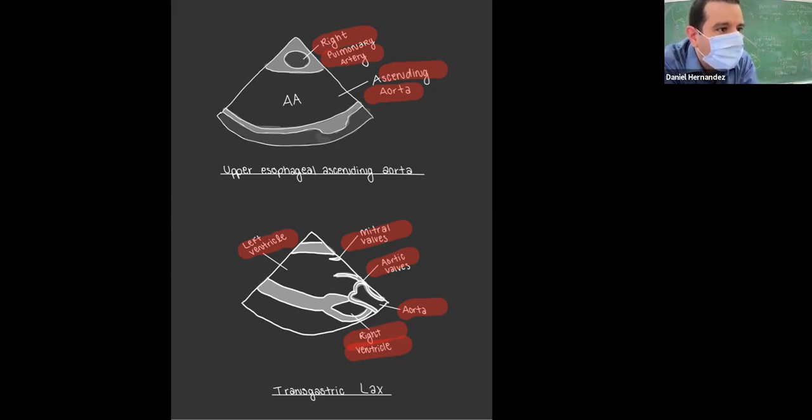I was trying to find the angle for that one, the pulmonary artery and the ascending aorta. Is the posterior mitral valve leaflet the one closer to the aortic valve? Yes. No, anterior. That's the anterior mitral valve leaflet. Just kidding.